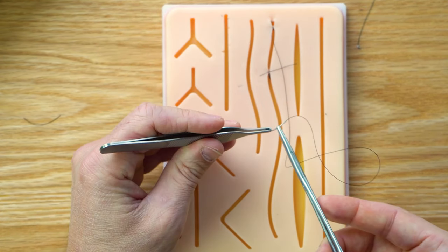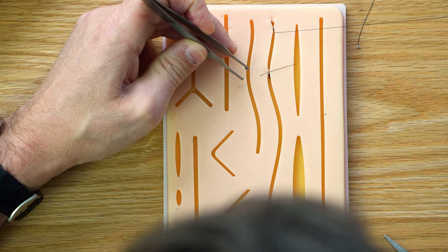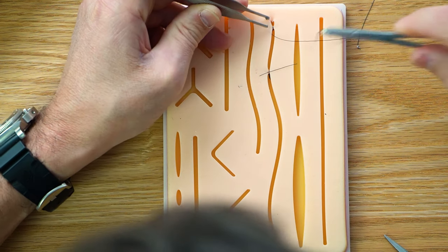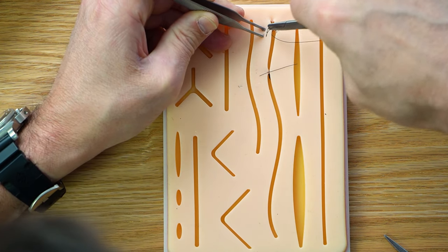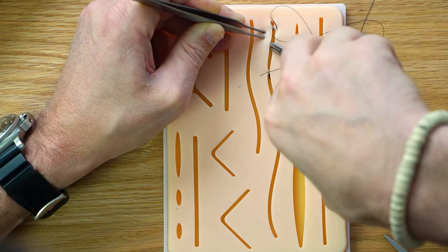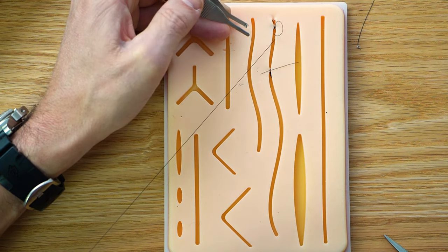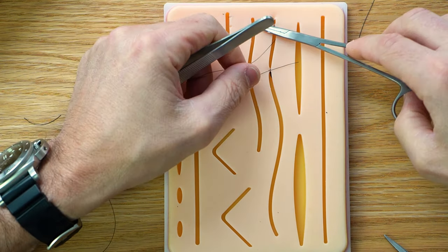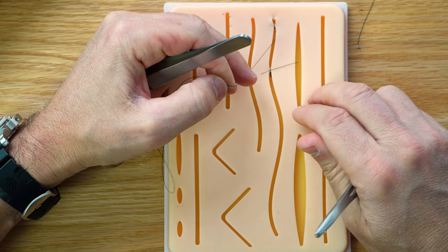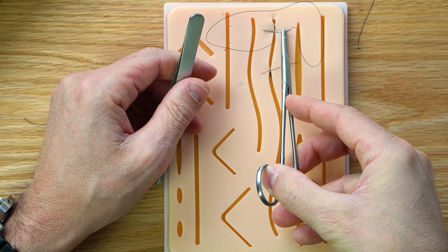And then the second one, same thing, I put my hand up here, and I pull it across and I say, that's my entry point for the next one. Okay, and then I go in here and then turn it out and it's gonna go that way. And then each time you come out, you are going in to the next site very close. It's either right across, parallel. Let's see, pull this tight a little bit. So that's gonna come together pretty good. It's a little bit of an angle, so you're either going across exactly like that or the next one, I might just go like this, put this angle here, I'll come in right there.